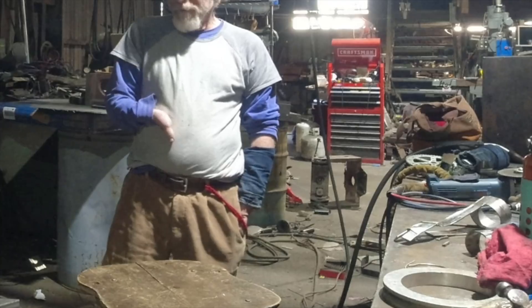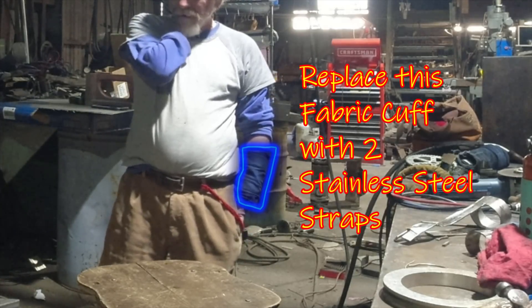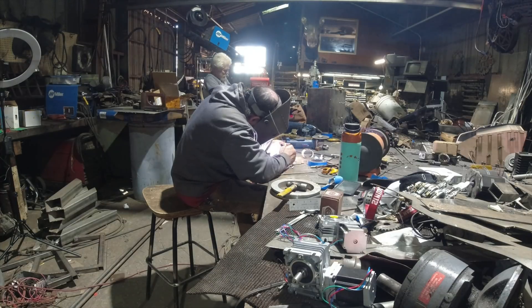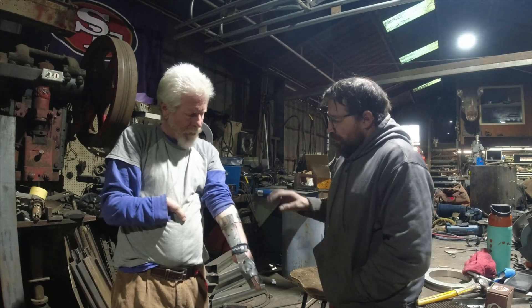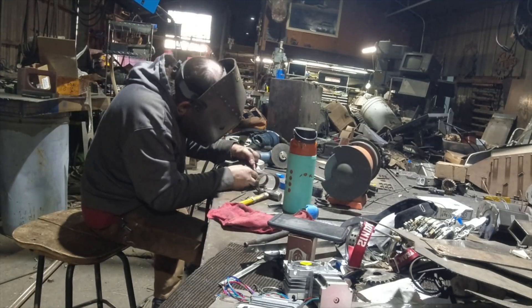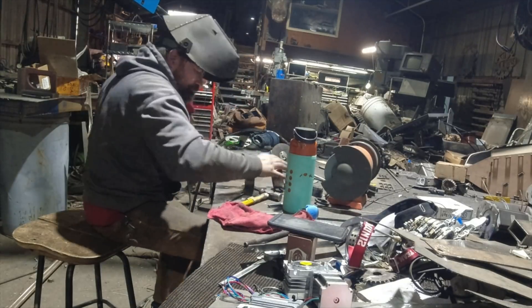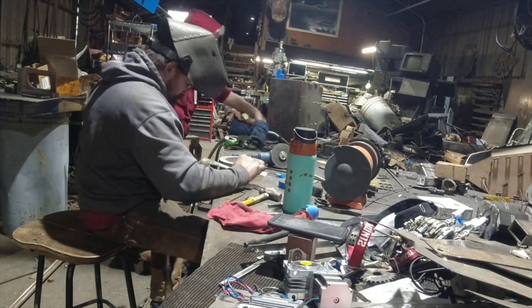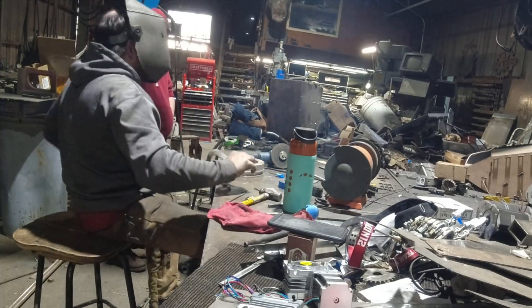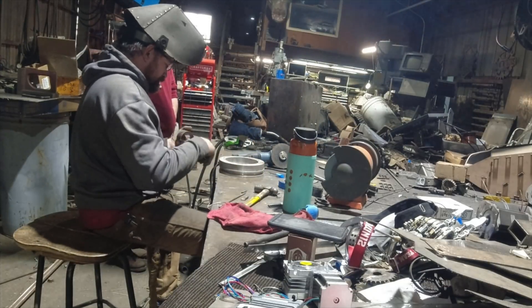At that time, we chose to replace the fabric cuff that he used to fix them onto his arm with a pair of stainless steel cuffs that I'd weld onto the prosthetic device. Because the cuffs are hard points, they needed to be aligned perfectly to his residual limb so that during vigorous use they don't cause hot spots. In order to get the positioning just right, what we'd end up doing is tacking the bands and waiting for them to cool, fitting them onto the forearm, checking the angle, and repeating the process until the fit was just right. Then I would fully weld them to the prosthetic and then we'd check the fit once again.